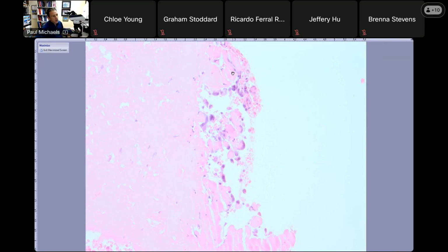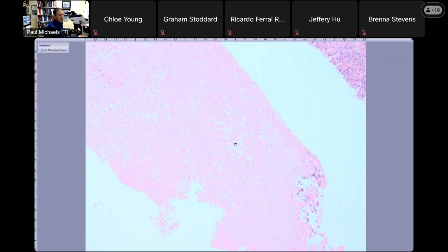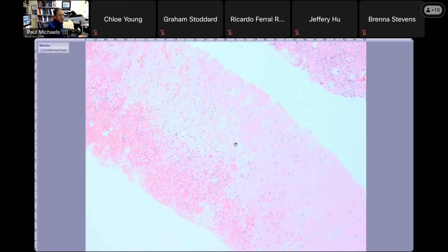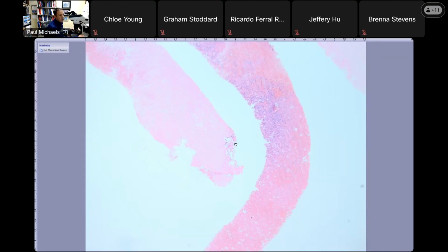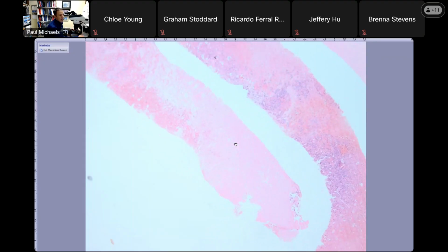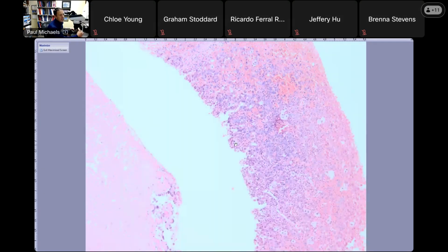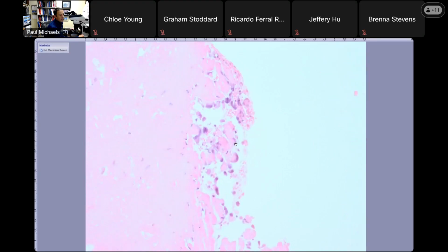This is an angiosarcoma. You get these really atypical cells surrounding fibrin when you look at the periphery. Because a lot of times, I think as you get older in pathology, your eye tends to skip over a lot of the pink stuff. When you're younger and new, you look at every single tissue piece on high power, but you kind of skip over what looks like necrotic and go to the viable stuff. But when you have a case like this, you really need to focus on this fibrinoid stuff, because that's where it will often give you the hint that it's an angiosarcoma.